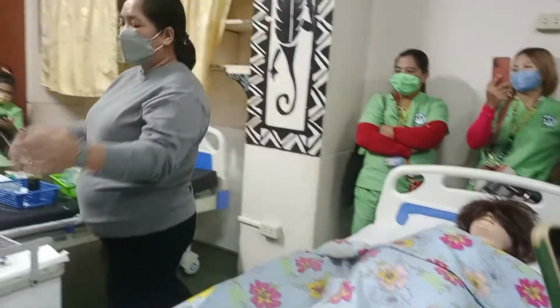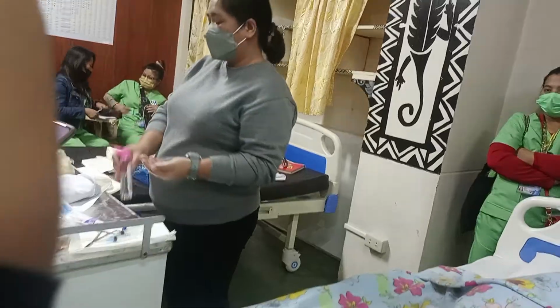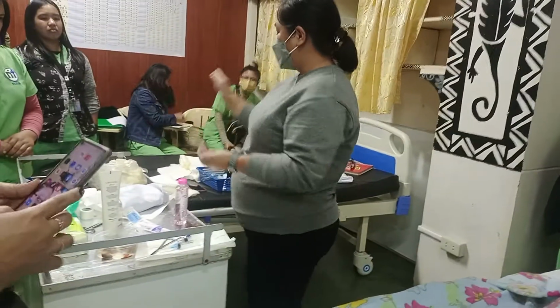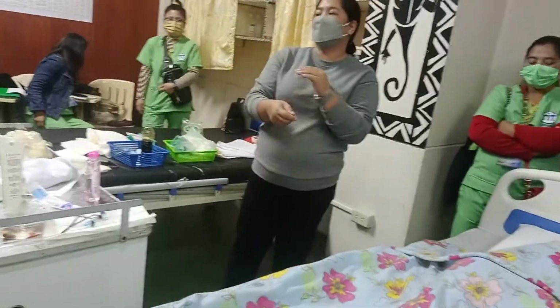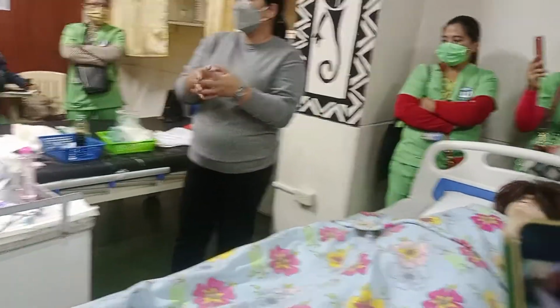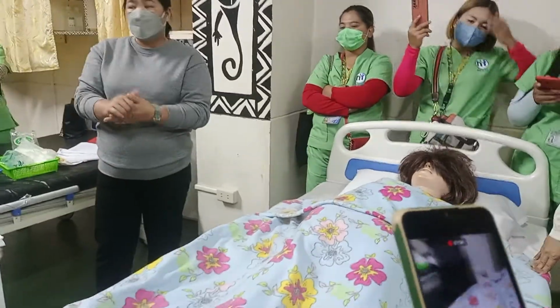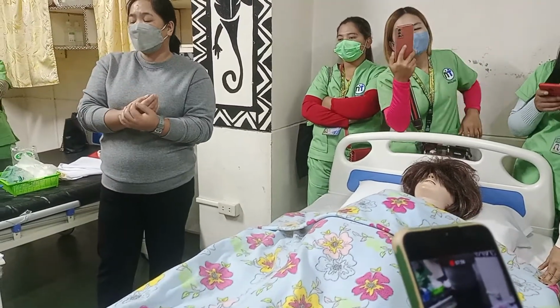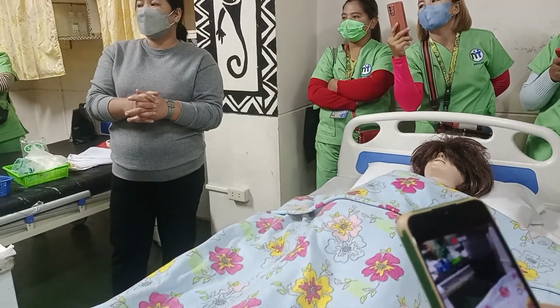Then, gather your equipments, sanitize your hands, and go out. Throw all that sa tamang lalagyan. And then, you're going to document. Mag-chart ka, mag-journal ka, na ginawa mo ng tama, that the procedure was done with utmost sterile technique and patient is safe.